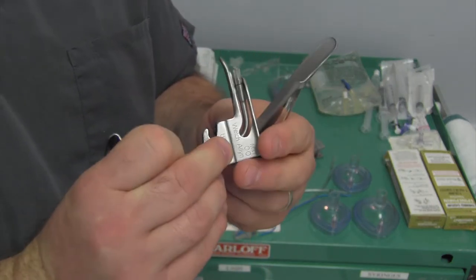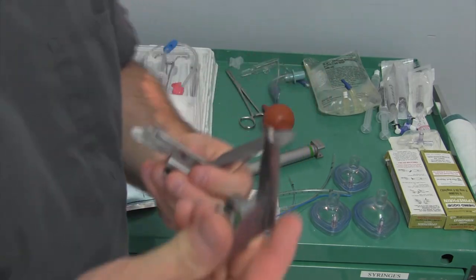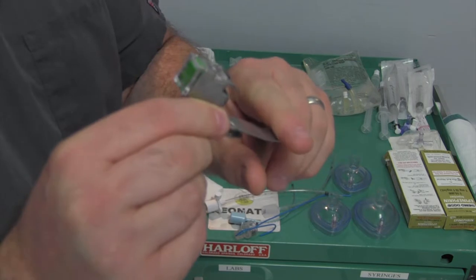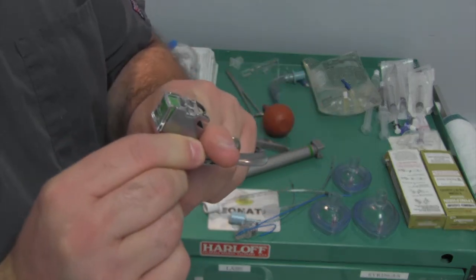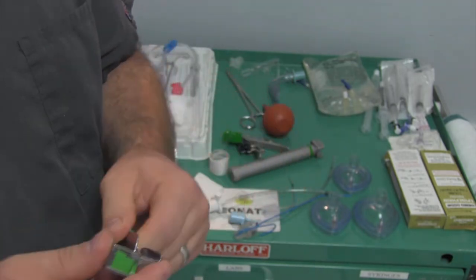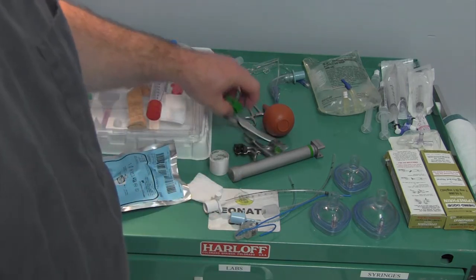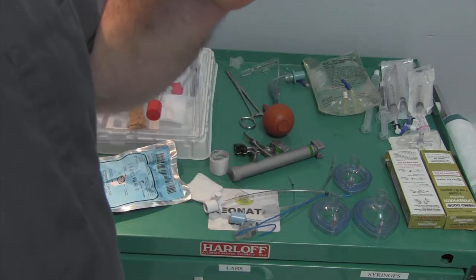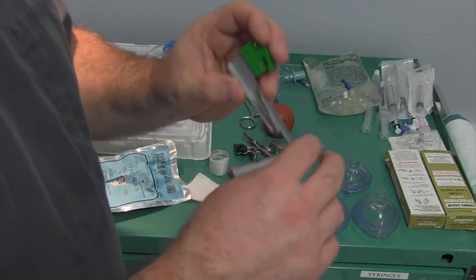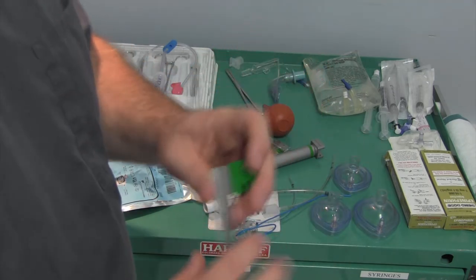Double zeros are fine to use, but usually you can do almost everything with the zero that you can do with the double zero because it's all going to be based upon how far you insert this in. You just don't bury it all the way - you insert it a smaller amount and make it work more like a double zero. So a zero is usually what you're looking for. With a one, it's pretty big for a neonate, so you're just going to use the front even third of it - not the whole blade.